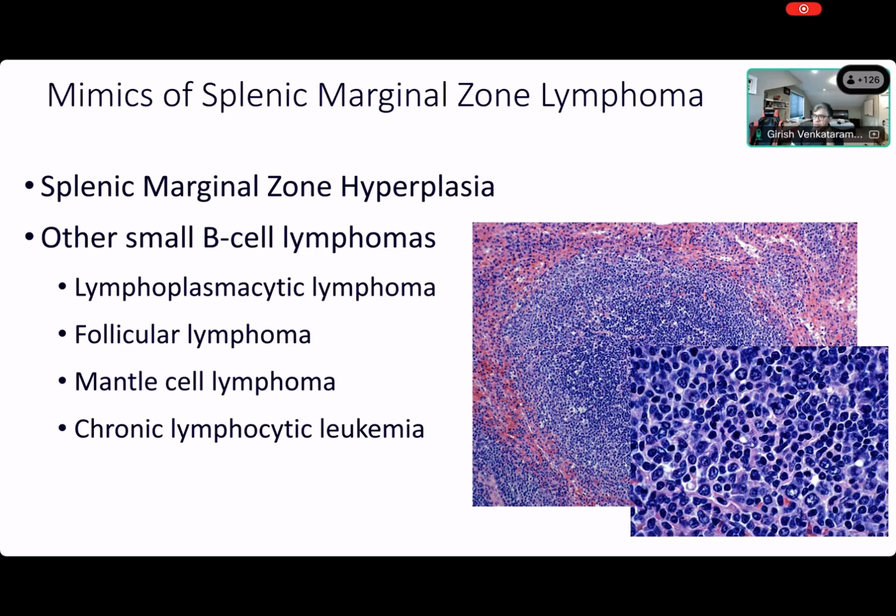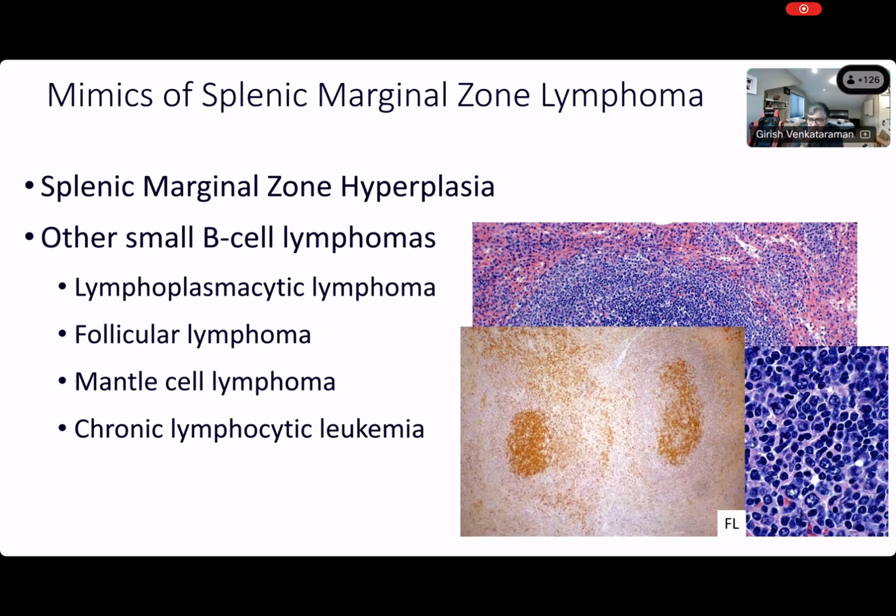This is to show you at high power what the cells are, the centrocytes, and the T cells, but morphology will only go so far. So you cannot go too far with morphology in the low-grade lymphomas, right? This turned out to be follicular lymphoma on the screen, right? So indistinct follicles, it turns out to be follicular.